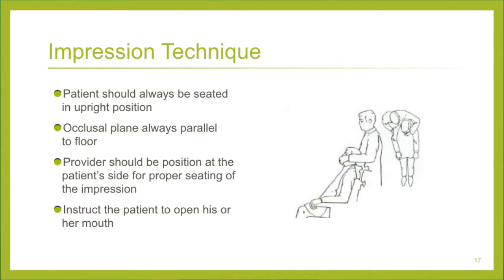That handle, and I've learned this from lab technicians, I cannot take the credit for this. Buddy Schaefer, who I have spent a lot of time with at Bayview Dental Lab, said, Shannon, you always want that handle lined up with the midline. I told you I spent a lot of time at Invisalign teaching a lot of Invisalign courses, and I had the pleasure of seeing how, when we ship our impressions, the impression material is scanned in the machine, and that handle goes right into the machine, lined up with the patient's midline. So we really need to see up and over.